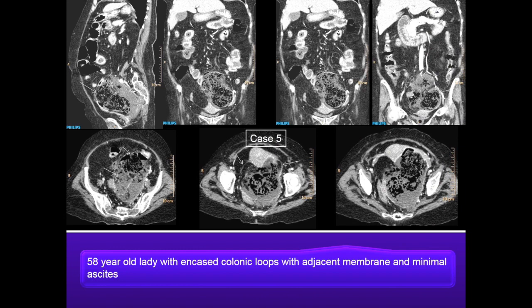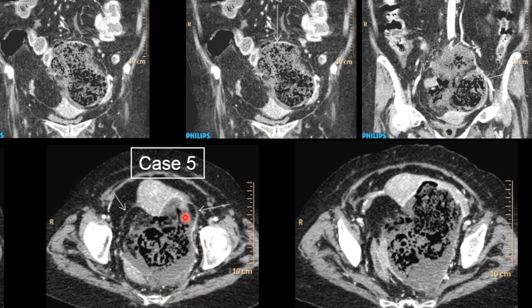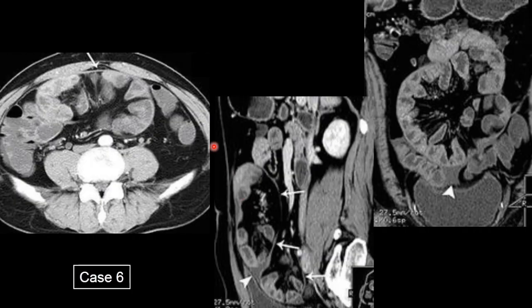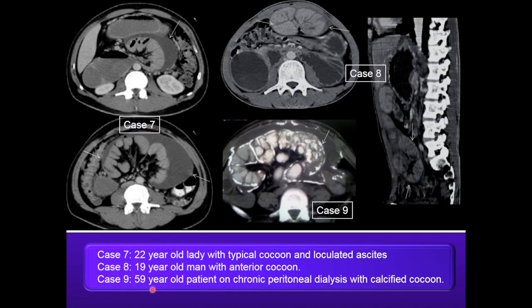The fifth case is a 58 year old lady who presented with encased colonic loops with internal feces. Adjacent ascites and membrane-like structures are seen with the uterus pushed anteriorly. The sixth case is a 22 year old girl with abdominal pain showing bowel loops encased by a membrane. A 59 year old patient with chronic renal failure on chronic peritoneal dialysis is presented with a calcified cocoon.